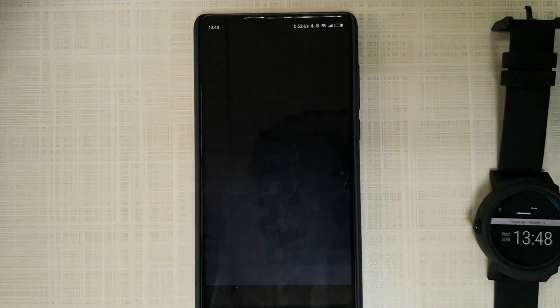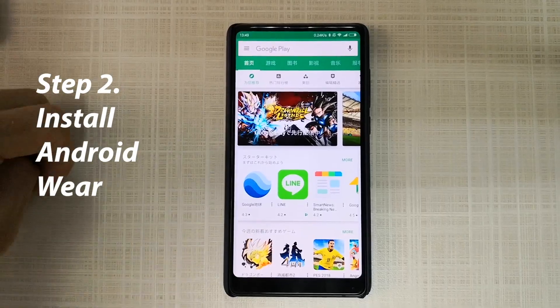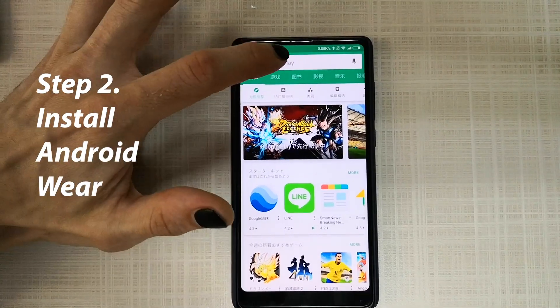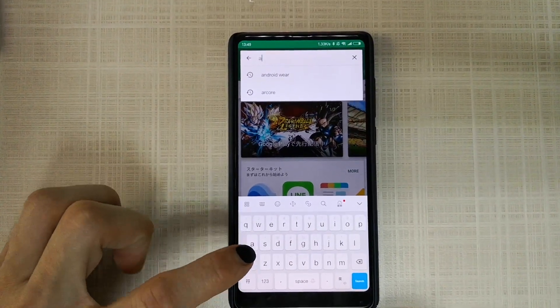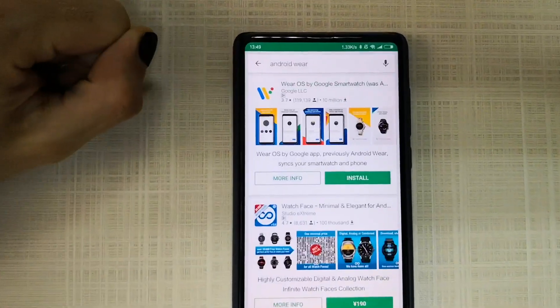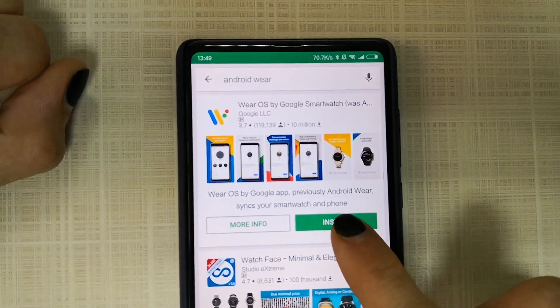After that, open the app. The next step is to install Android Wear on your phone. Go to Google Play, search for Android Wear, find it, and install it.